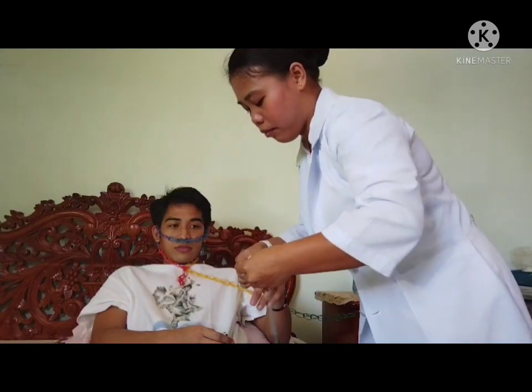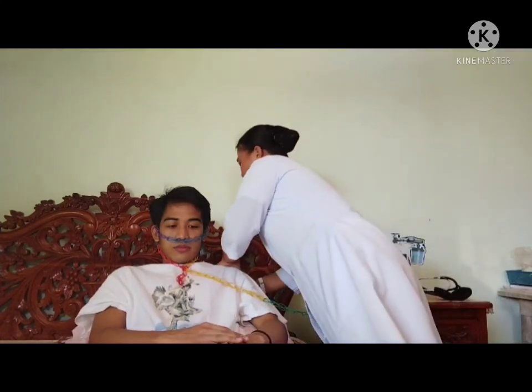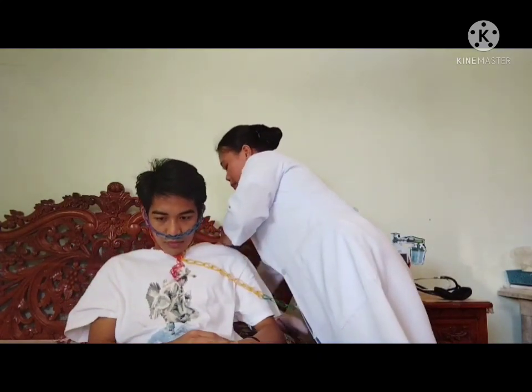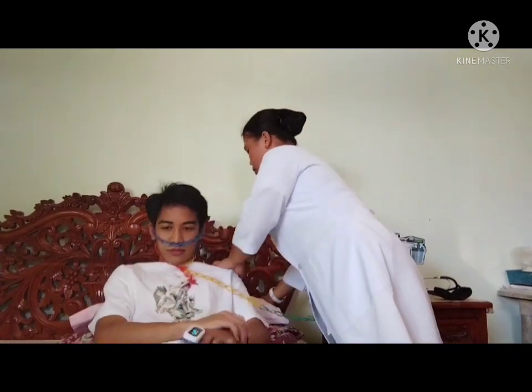Reassess the patient's respiratory status, including respiratory rate, effort, and lung sounds. Note any signs of respiratory distress, such as tachypnea, nasal flaring, accessory muscles, or dyspnea.